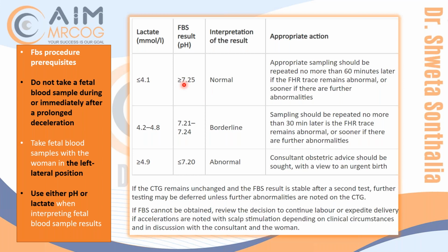Fetal scalp stimulation? No, scalp stimulation is not for this purpose. Once you are doing sampling, we basically look at the CTG. If it is recovered, we will continue. If it is not recovered, we can repeat the fetal blood sampling in 1 hour. Very good. So if the trace is still pathological and I did the sampling, it was normal, still I'm worried, I'm sitting tight. So if the trace is still pathological, I'll repeat it in 1 hour's time. But if the trace improves, nothing to be done, right?